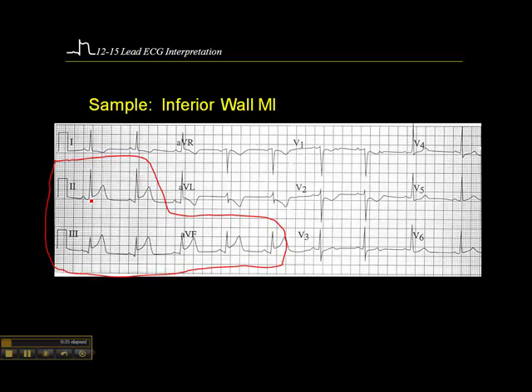Right off the bat, in lead 2, we have the baseline here — the J-point is elevated about 2, maybe 3 millimeters. In lead 3, we have the baseline here and the J-point is elevated.